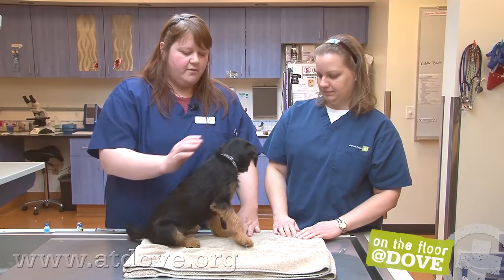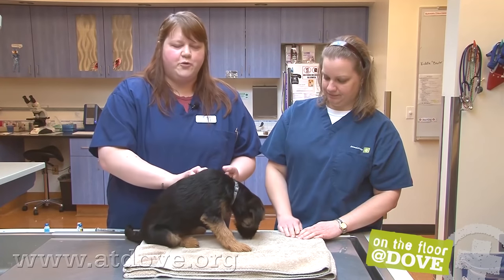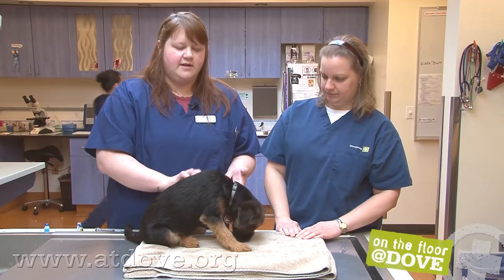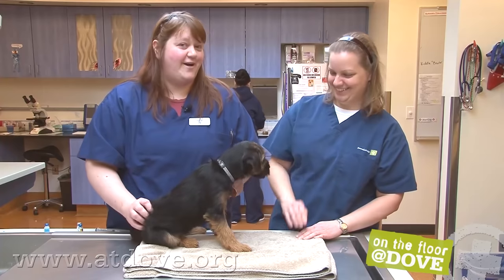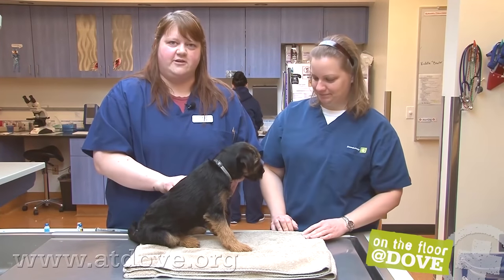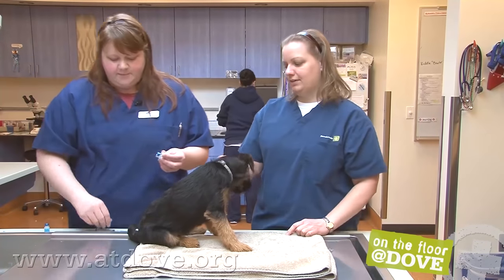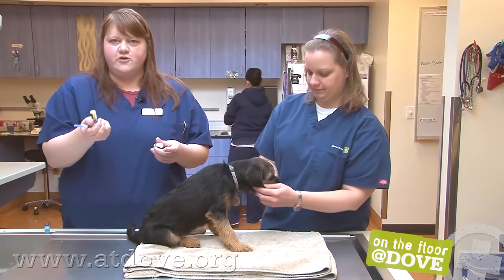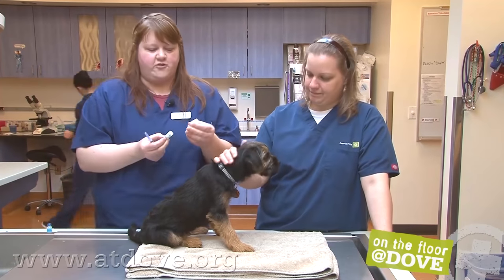I'm going to draw up his Bordetella and his distemper parvo. We give the Bordetella last because the injectable one can sting — it's not uncommon for them to cry a little bit or start scratching at that area. So we'll start by drawing up the DAP vaccine. Because it's freeze-dried, we have to mix it up, and you only use the diluent that comes with it from the manufacturer.